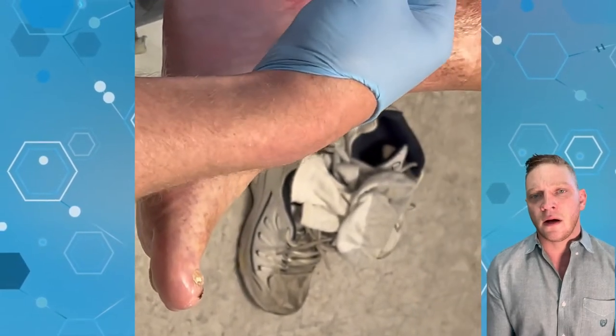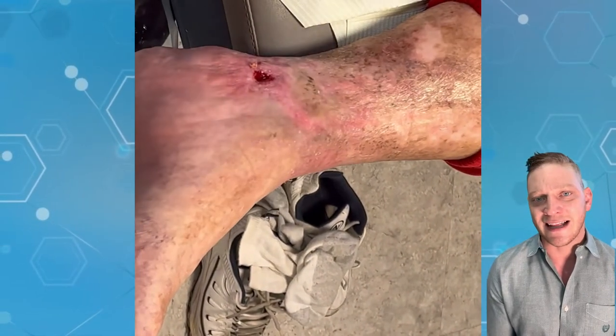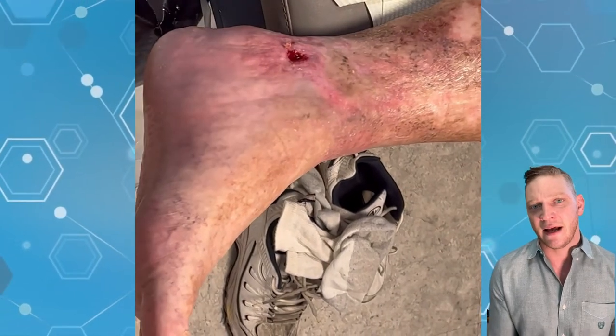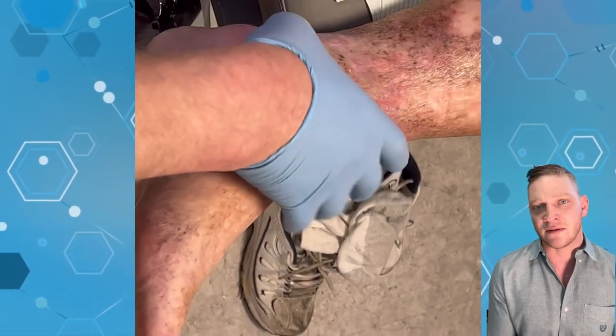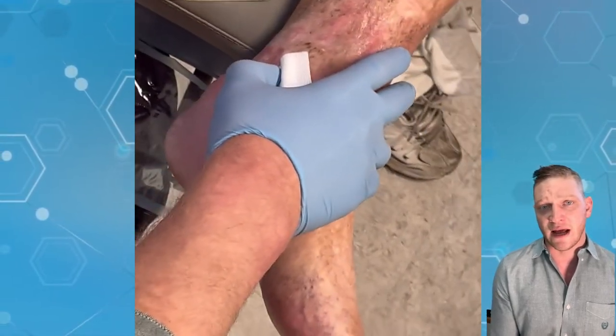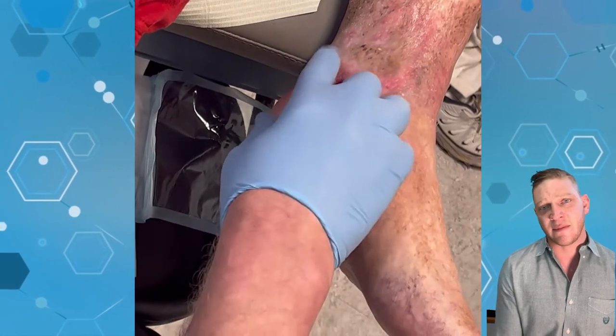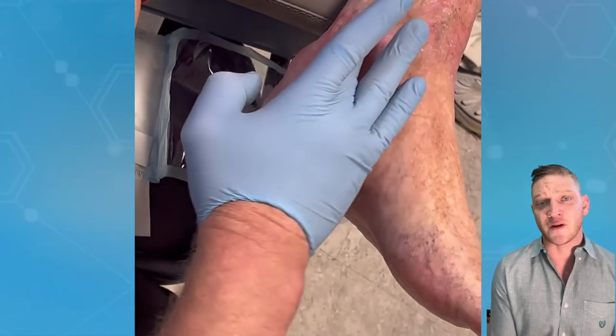Typically what that means is that you don't really want it there. Santyl is the product that I'll be using — it's a collagenase, it's an enzyme that actually dissolves and destroys the collagen, which is pretty much what that fibrotic tissue is made out of. We want to remove that so it doesn't inhibit any wound healing.